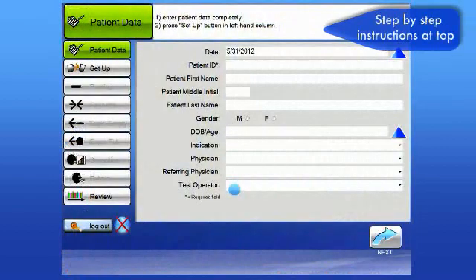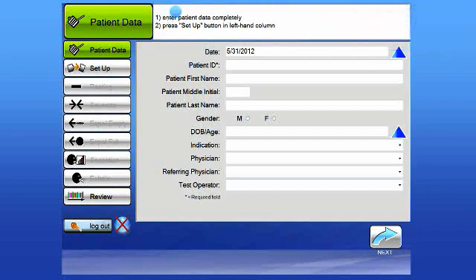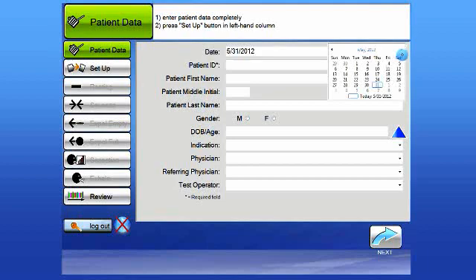Instructions to this screen are located at the top as shown here. The only field that is required is the patient ID field. The rest is optional, but most clinics would be entering this information. The date is automatically entered. If for any reason you need to enter a different date, you may do so manually.